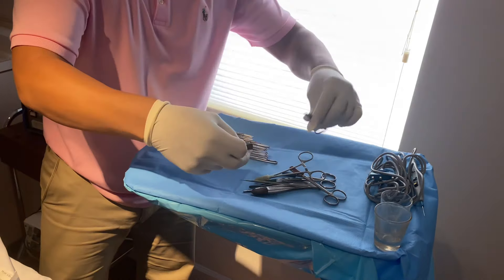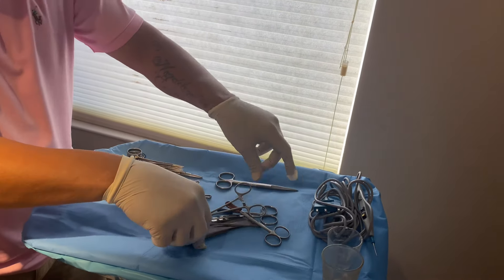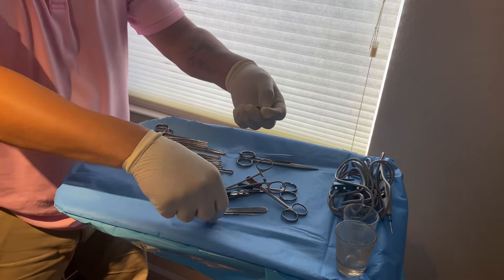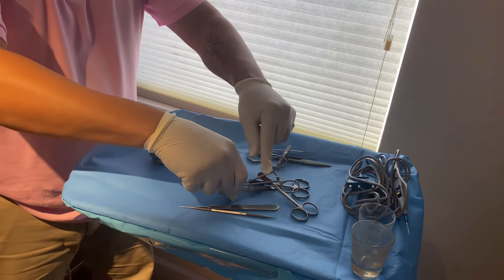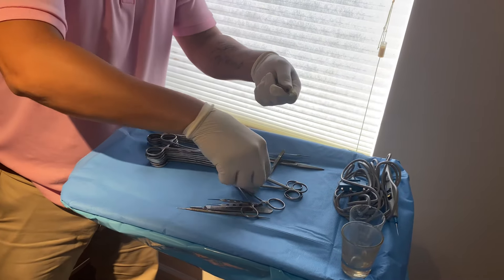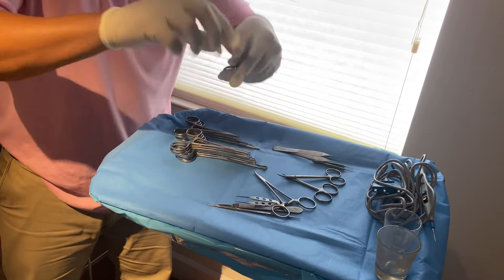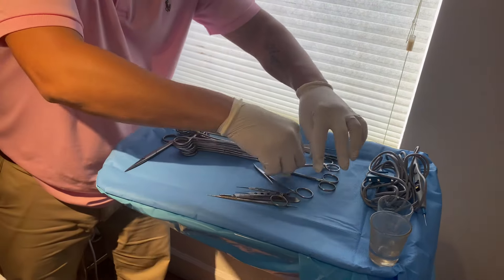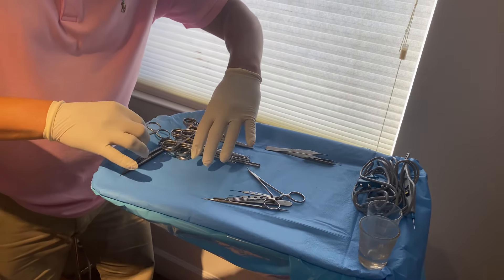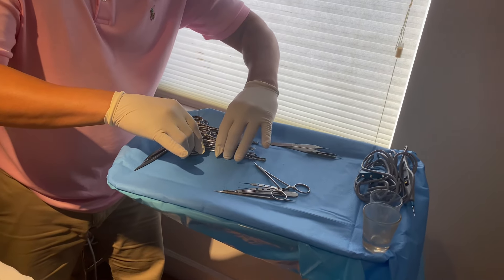I'll take off these tips — every single sharp instrument has a tip on it to prevent it from penetrating the sterilization pouch. We have three scissors. As you can see, they're all different sizes. I put the larger one on the bottom, the middle size in the middle, and the small one on top.